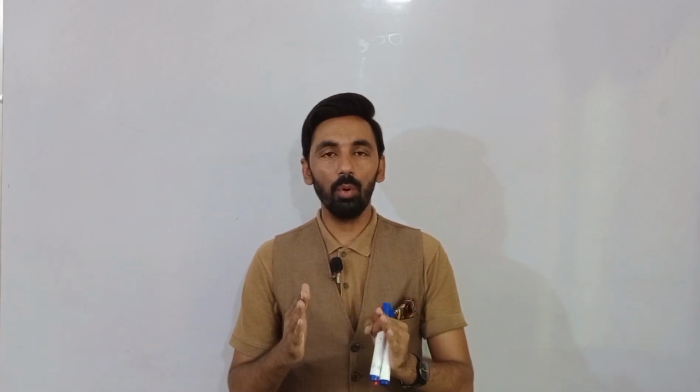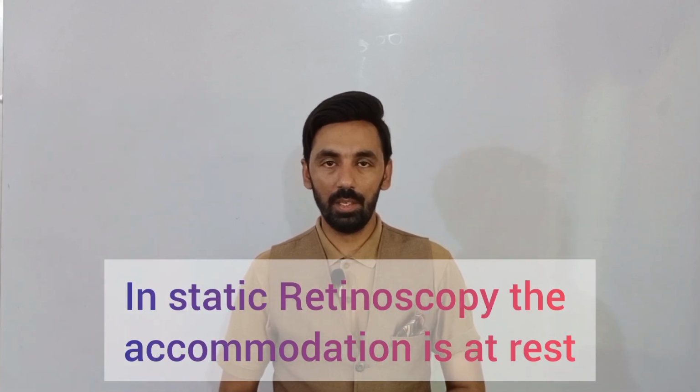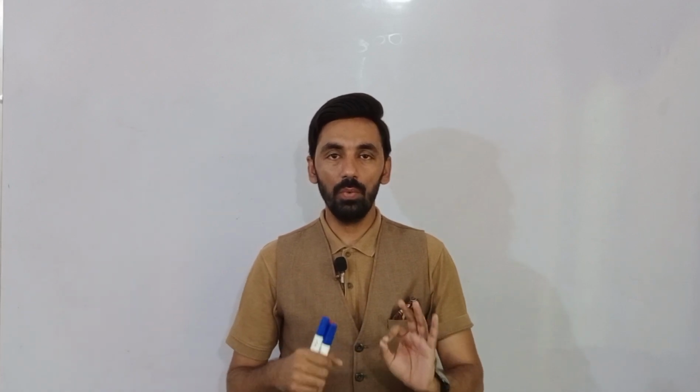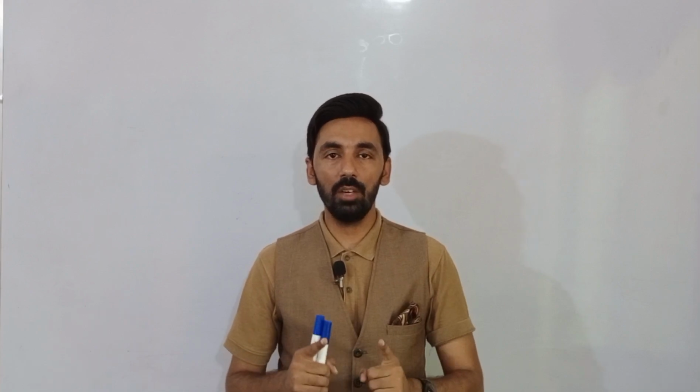In static retinoscopy, the accommodation is static, fixed, means the accommodation is at rest, accommodation is paralyzed. So in all types of static retinoscopy, we have to keep in mind that accommodation should be at rest.